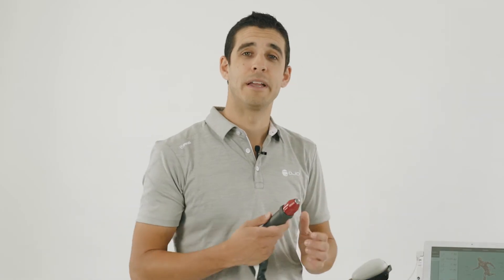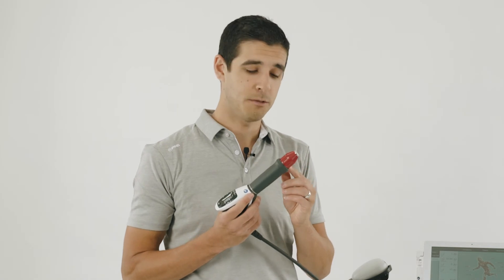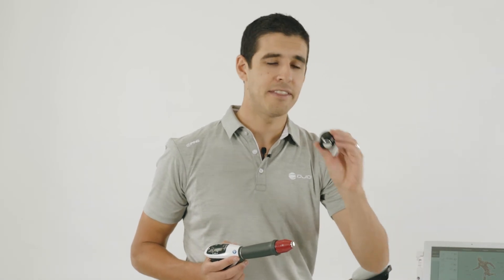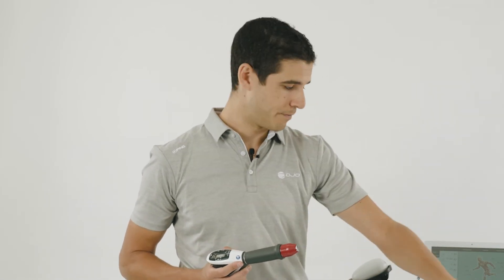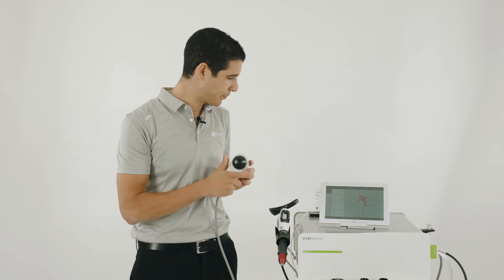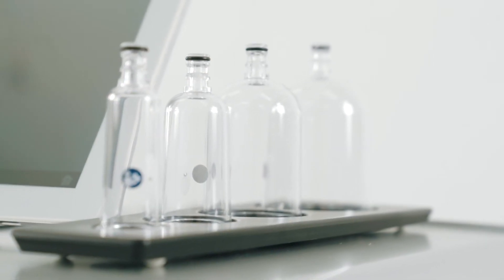The radial shockwave handpiece comes standard with the RO40 transmitter, the deep impact transmitter, and the D20S muscle transmitter. The V-actor can be purchased as an optional extra; however, the cupping does come standard.